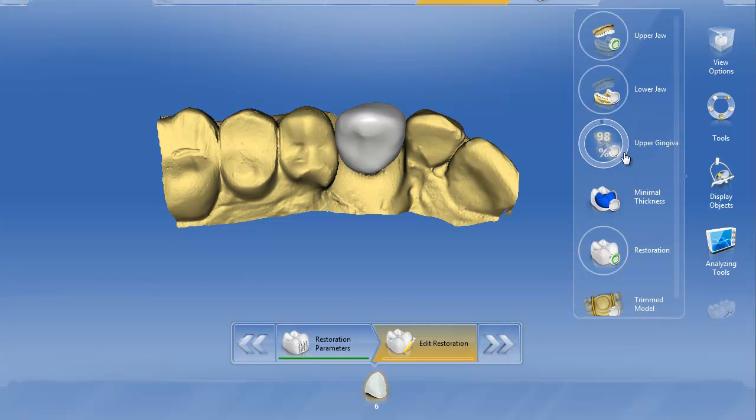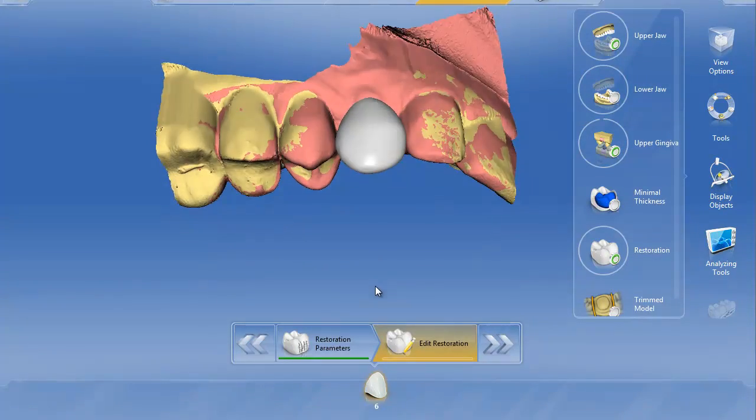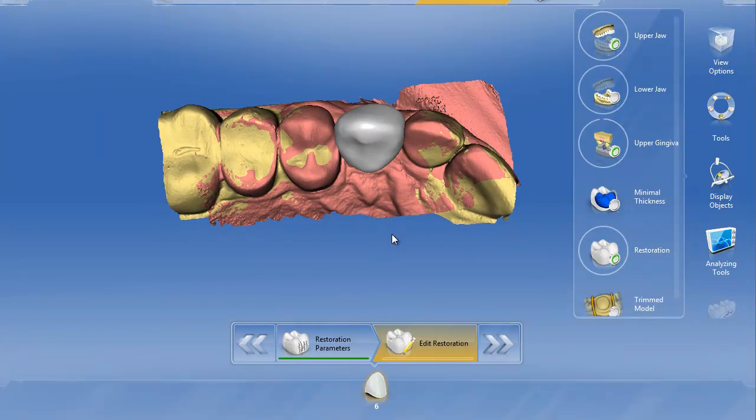We can put our upper gingiva on to see we've got our nice emergence formed, ready to form that tissue. The first thing we're going to do is turn the restoration transparent. Now we can see the top of that Glidewell tie base.